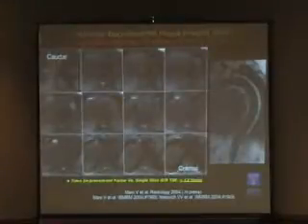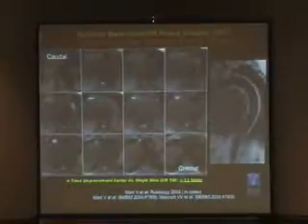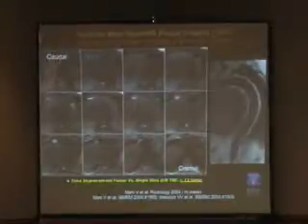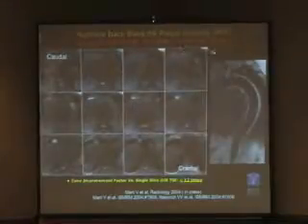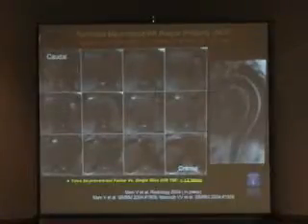I'll just make a little comment here on time, because one of the things that is always mentioned is, oh, MRI takes a lot of time to do. That is actually not true. We're not talking about looking at cardiac function here, where you have to average over multiple cardiac cycles, and it takes more than 20 minutes to an hour to do the exam. I'm showing you here an example covering from the top, the subclavian, all the way down the aorta in a longitudinal axis. This is something that's actually obtained in less than a minute.